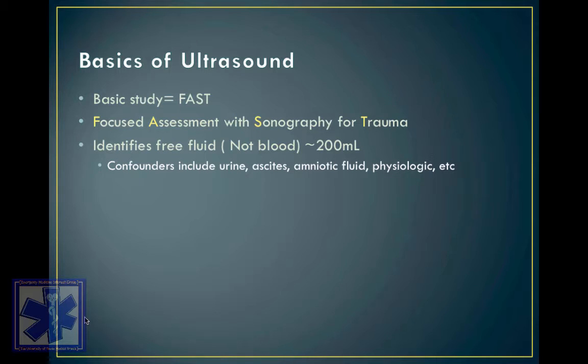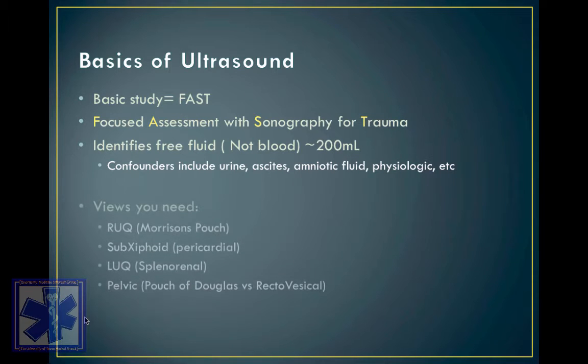Now when you put the Foley in, there's pure blood out, and they have a decompressed bladder, and there's a giant bladder rupture when they X-lap them. Yeah, it was probably blood. But I just see fluid. I can't tell you what it is.